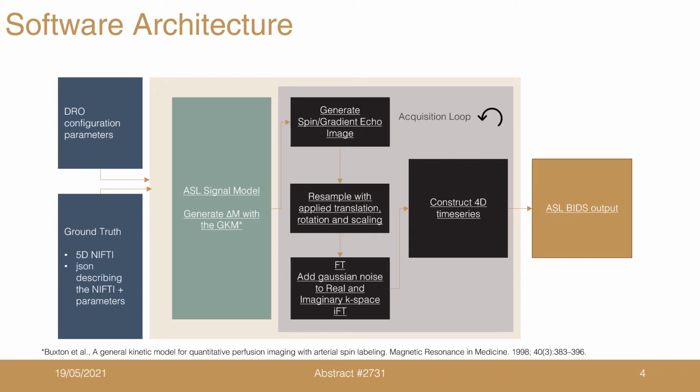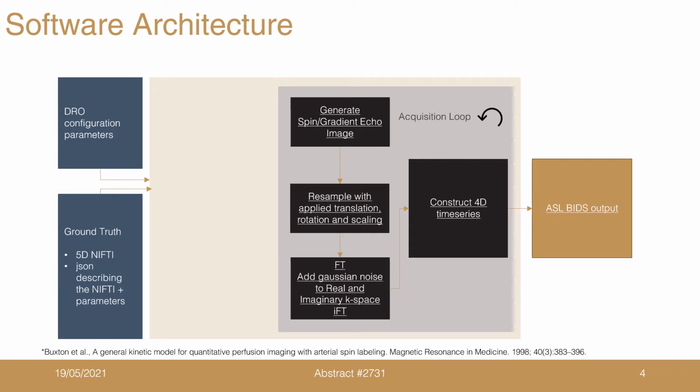format. By omitting the ASL signal generation, images with T1, T2 or proton density contrast can also be generated. By also omitting the MR signal generation, we can resample and transform the input ground truth quantity maps. We have implemented the software in a highly modular way, making it possible to extend and reuse components in new pipelines, and all the methods are fully documented.